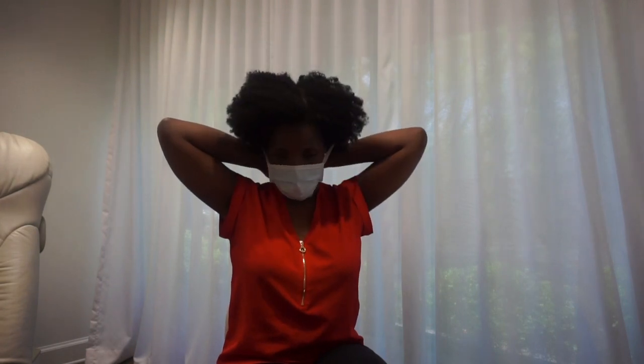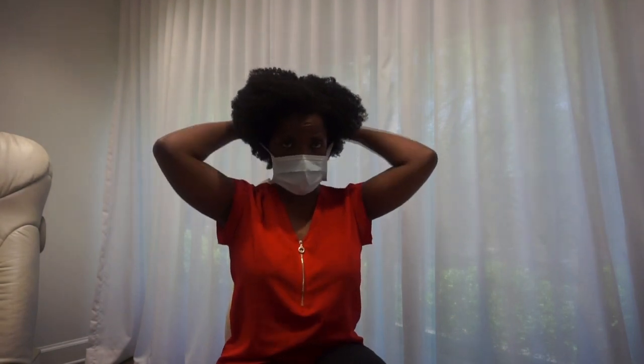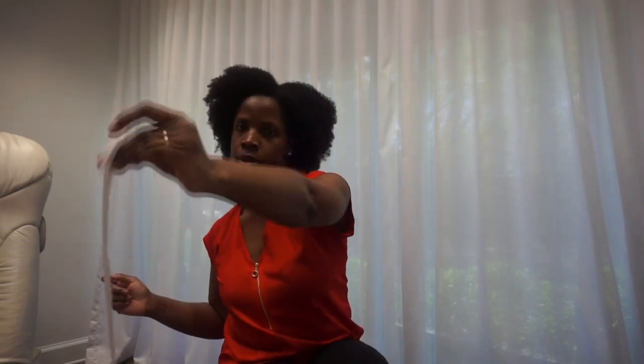The important thing with this mask is again making sure that when you remove it you don't touch the front, because you've defeated the whole purpose. To remove it, untie it from the back on both sides, take it off, and place it with the inside facing down either in the trash if you're not going to reuse it, or on a surface or in a bag to keep it protected. Always wash your hands before and after. That's a basic tutorial on how to put on and take off a mask.